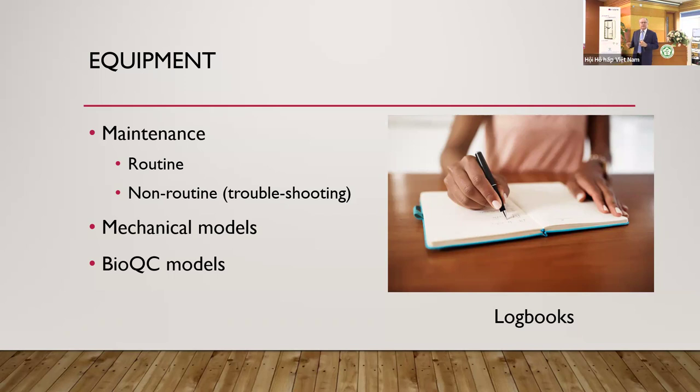And all of these processes should be documented in a logbook that's associated with that piece of equipment.